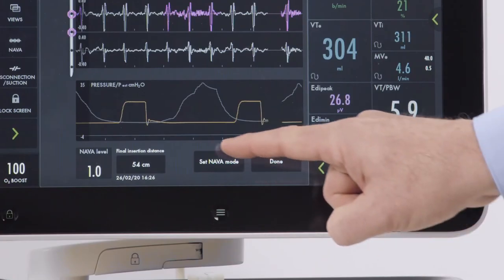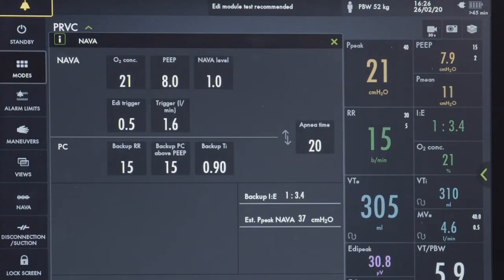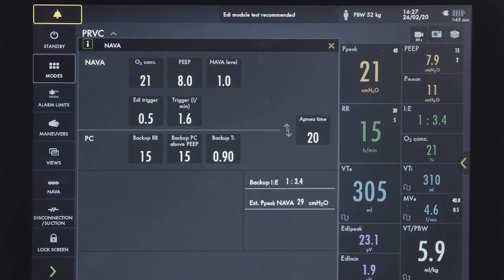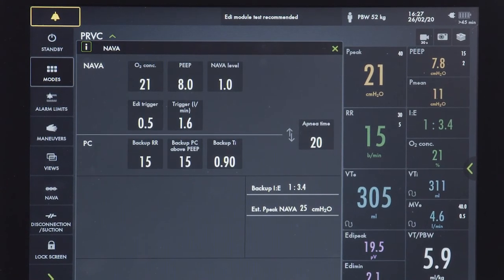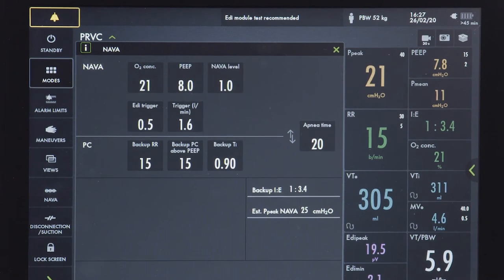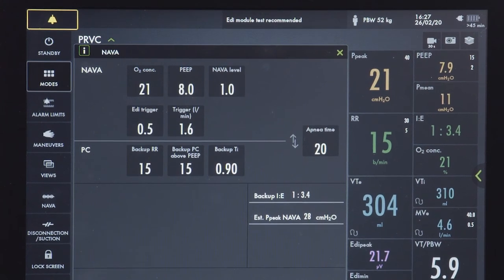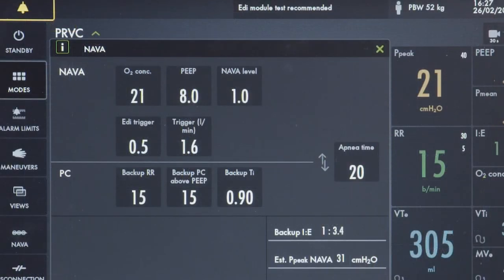Now go to the set NAVA mode tab. The NAVA mode is divided into NAVA mode and pressure mode. The apnea time is also set in the mode window. The NAVA level can be set in the catheter positioning window, and when it is changed, the pressure estimate changes accordingly in the curve. The NAVA level is the factor by which the EDI signal is multiplied to adjust the amount of support delivered to the patient. It reflects the amount of work of breathing that the servo ventilator will take over from the patient. The appropriate NAVA level varies for different patients and may also need adjusting over time in the same patient.